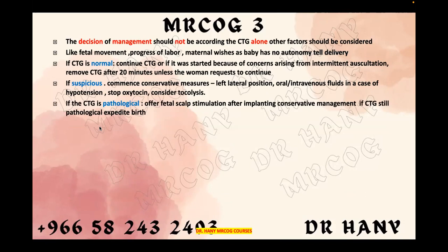If the CTG is pathological, offer fetal scalp stimulation. In the new NICE guidelines, they put a concern about fetal scalp stimulation. If the CTG improves, you will continue the normal care. If the CTG does not improve, you will expedite the birth either by operative vaginal delivery or cesarean section.